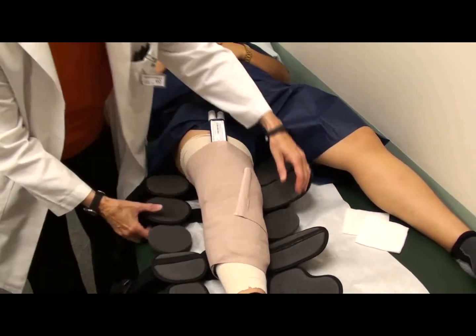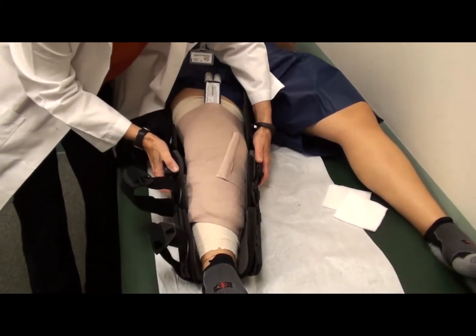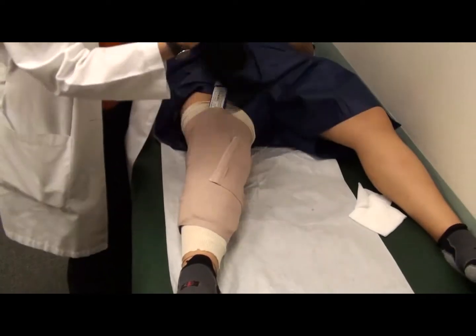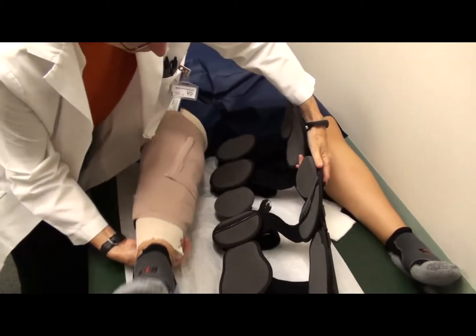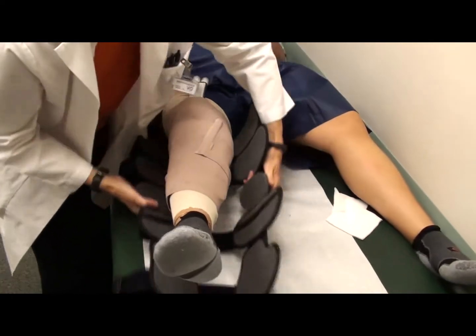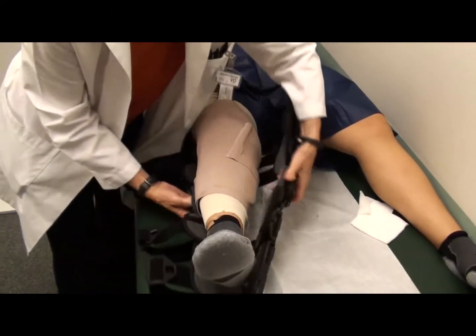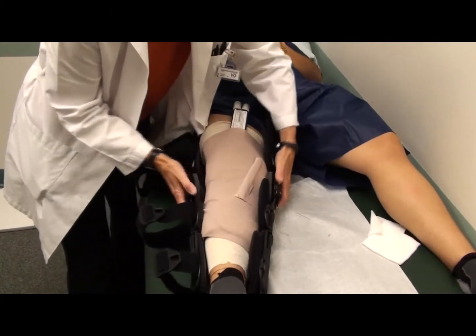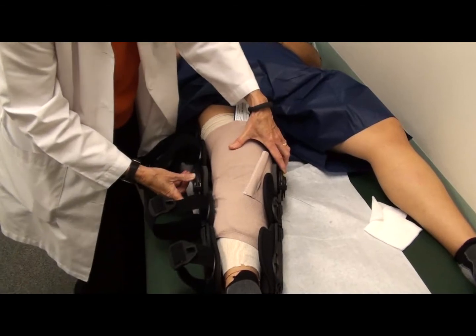You're almost done. So the last step is to get the brace lined up. Now let's say the brace is sitting over here. Let's say you flip it off and you go, okay, now I got to put this back on. Oh my God, what am I going to do with this? So if you can lift your leg up, you grab the two hinges. There's a hinge on one side and there's a hinge on the other side. You grab the hinges and you put it right at the center of the kneecap. So here's your kneecap, so put these like earmuffs on a face.